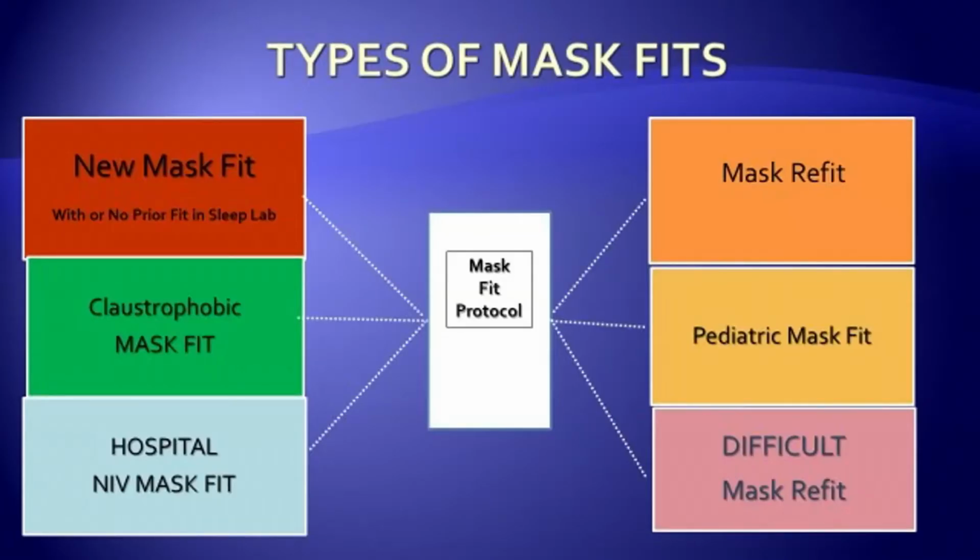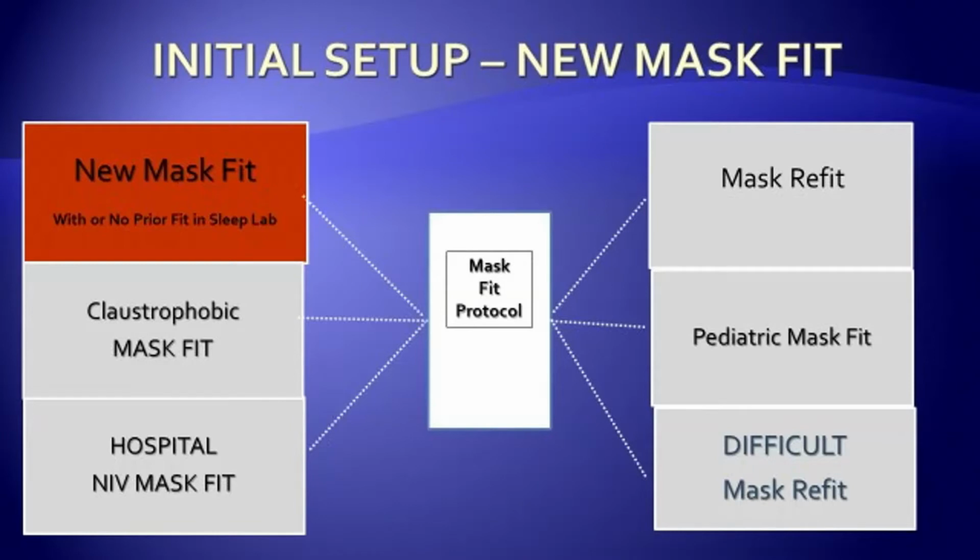In this slide, I'd like to show you a few of the numerous mask fit situations that require a planned strategy in order to succeed. They all are different and need a different approach. The first one is basically our new setup, either of a CPAP or a BiPAP. This is a teaching situation in which we must emphasize practice. We're trying to coach the patient with regards to how to operate the equipment, how to put on the mask, how to troubleshoot, how to clean. So we're teaching this patient, and we also should be going back to see if the patient is retaining this and understanding it. We need a lot of coaching in this situation, and at the same time we're trying to reduce stress and anxiety the patient may have of doing this.